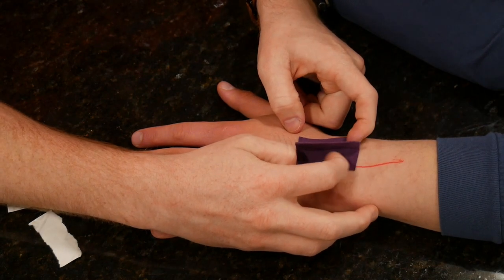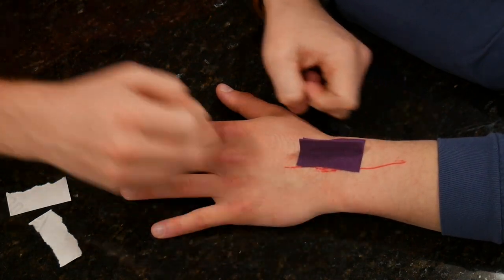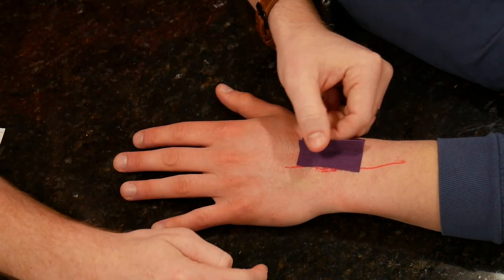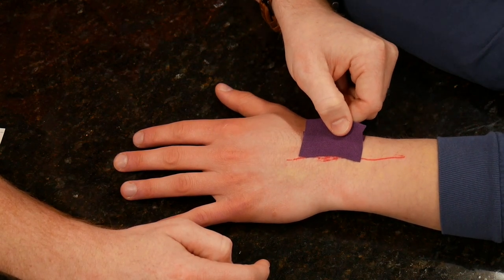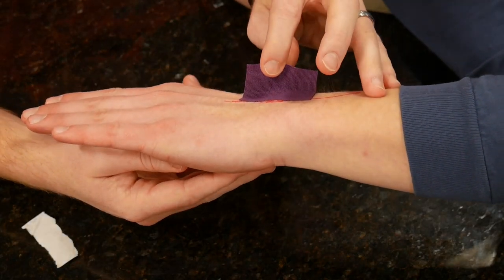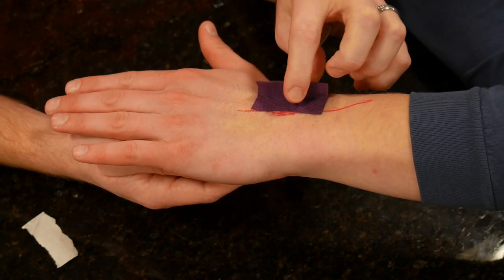You can do it right on top of it. You can get creative with this. You just do it wherever your patient really needs it. And now that you've got that good and rubbed in, I want you to watch this scar here. I'm going to pull this way, and you see how much that skin is moving and that scar is moving with that tape. All right, so here's another view of us pulling each direction on that scar.